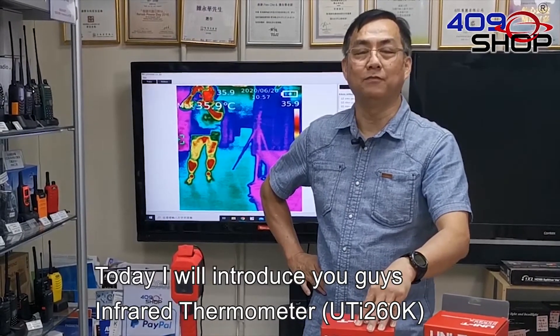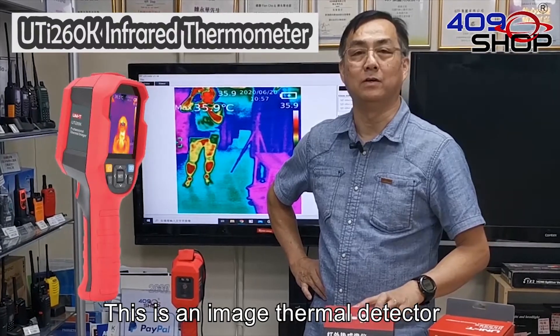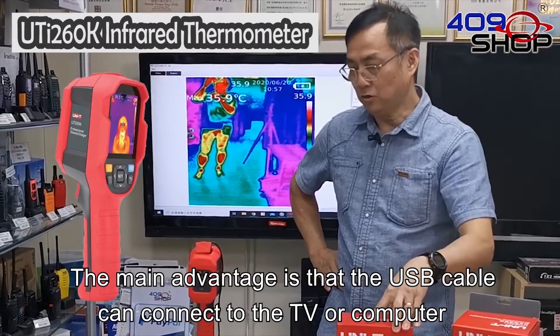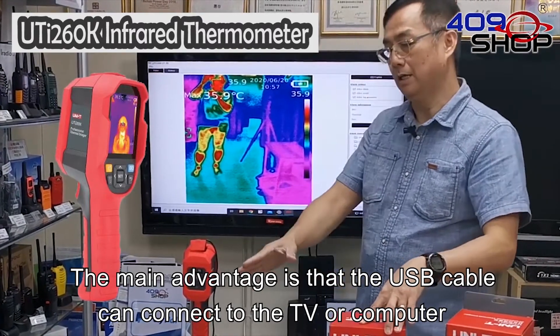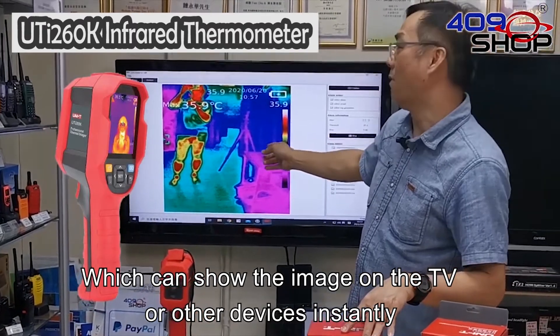Hello everyone, today I will introduce you guys to the infrared thermometer. This is an image thermal detector. The main advantage is that the USB cable can connect to the TV or computer, which can show the image on a TV or other device instantly.